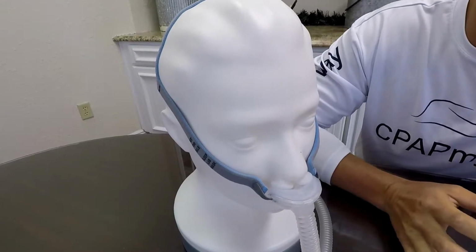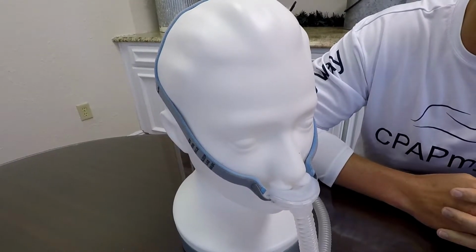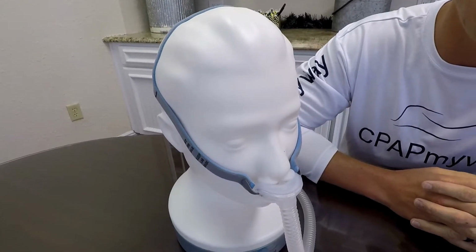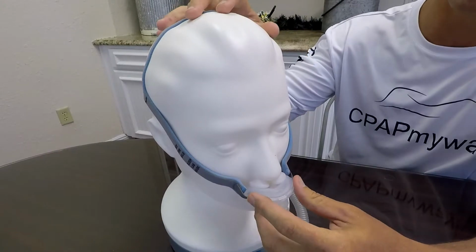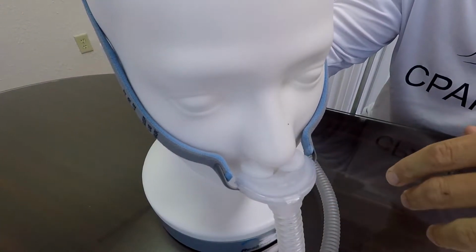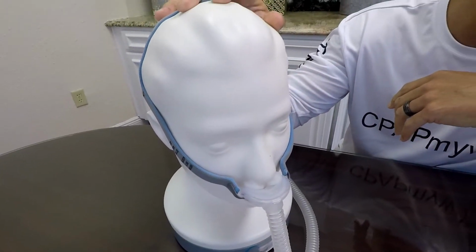You can't be a mouth breather and use this. So if you wake up and have dry mouth in the mornings at times, nasal pillow is a bad idea. And again, the only real downside we get over and over on this is that exhaling through nasal pillows can be a little difficult, especially at higher pressures.